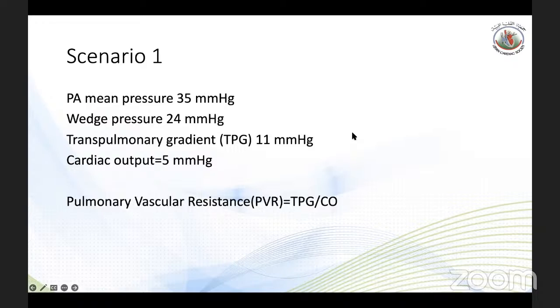If the patient is on warfarin, especially if you're going to the femoral, you need to use ultrasound in these cases to avoid any bleeding complications. Also, as I mentioned, always make sure that the balloon is up when you're in the ventricle to avoid any dysrhythmias. Those are important points to remember, I think.